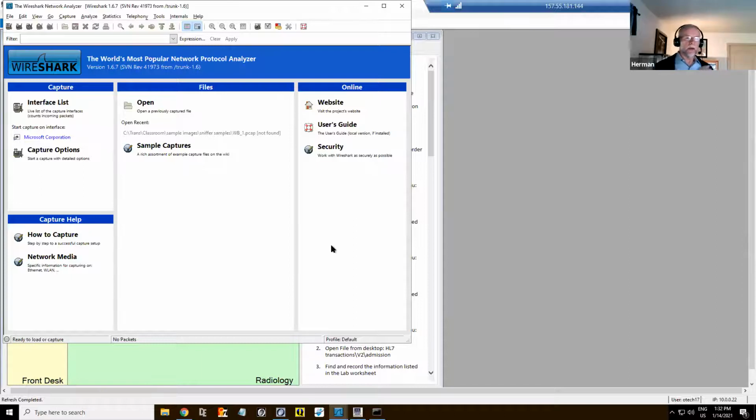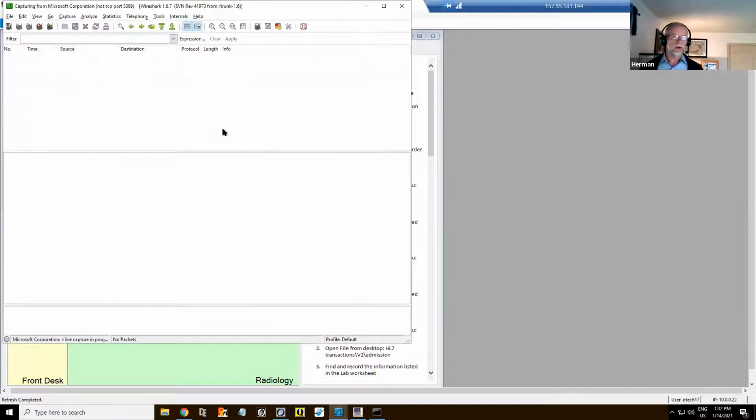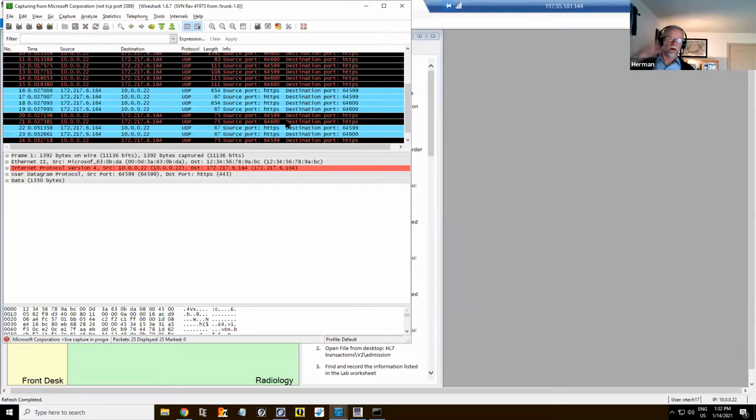So what we need to do is set up our preferences, then we do start. Okay, no big deal. We go to capture interfaces. Now this is kind of easy because in this case, we only have one interface. See, it's running. I don't know if we can see that. See these little packets going back and forth. And if I do start, then the capture starts, see?